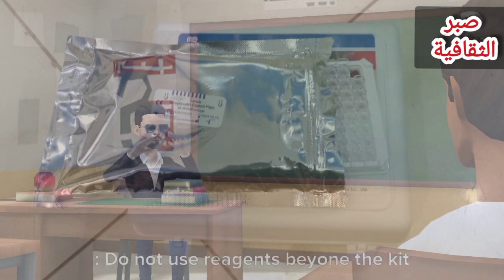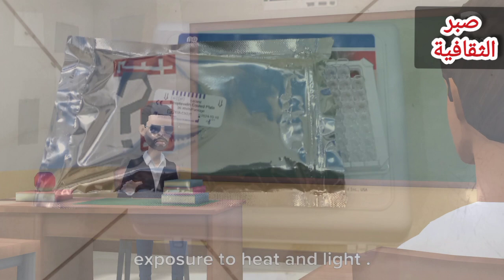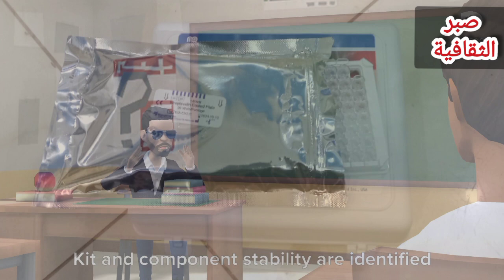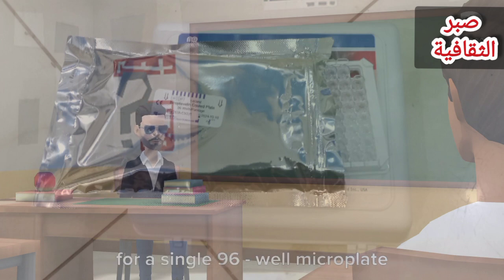Note 1: Do not use reagents beyond the kit expiration date. Note 2: Avoid extended exposure to heat and light. Opened reagents are stable for 60 days when stored at 2-8 degrees C. Kit and component stability are identified on the label. Note 3: Above reagents are for a single 96-well microplate.